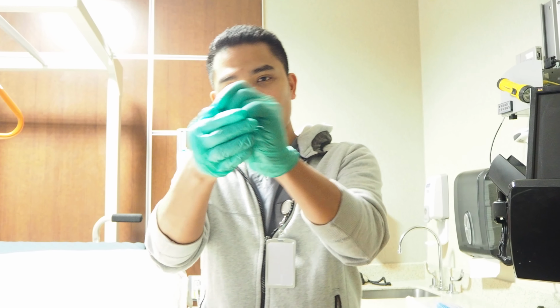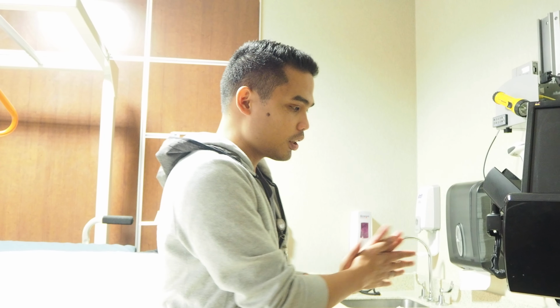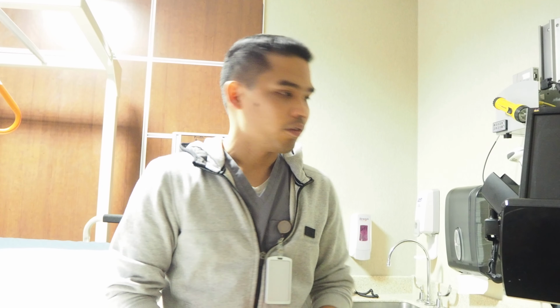Once everything is done, position the patient and make sure they are comfortable, remove the PPE, dispose of it, and wash our hands. Once outside, we should also take note of the volume the patient was able to reach. Take note and chart it, and if the physician or the nursing charge is present, we should also make them aware of everything that we did to the patient.